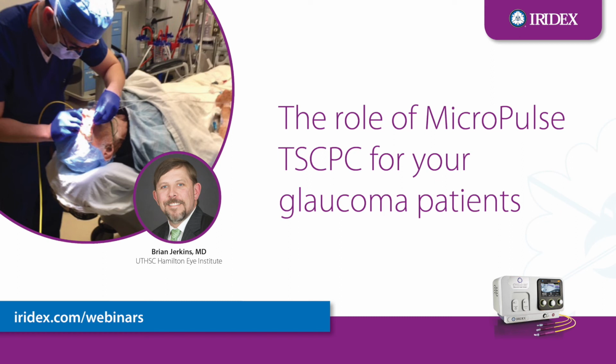That's the way I do it traditionally currently, but I have done it what I would call topically in many patients. Maybe they're not a great anesthesia patient, or they have various reasons why we need to do it that way. I've done it in clinic several times, just under topical, or I'd say topical and subconj anesthesia, but it takes a little bit of time. It's the patient who I systematically numb up over about 30 minutes and then kind of cherry pick their ability to tolerate a little bit of pressure on their eye for a few minutes. So I think it is a topical procedure if you have a good patient, but a little bit of mild sedation makes it just extremely easy for them.